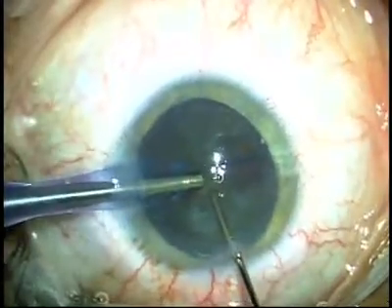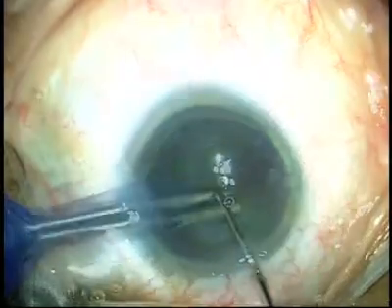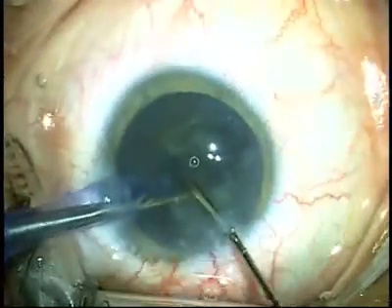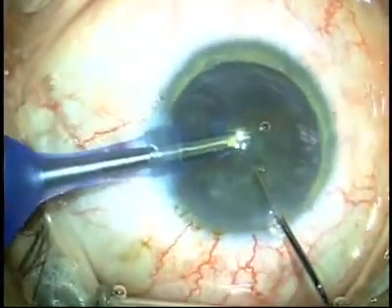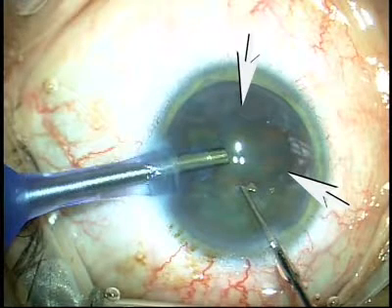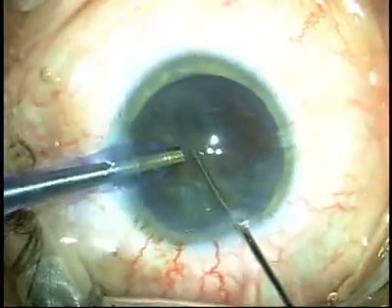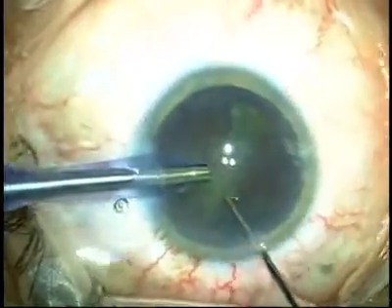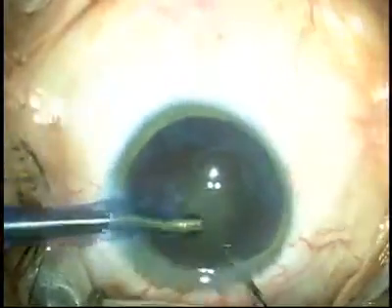Deep coring of the nucleus is done here along with cracking. Once this is done, the pieces are brought up into the anterior chamber very carefully, and you can see a very nice bounce in the area illustrated by these arrows. This indicates that the Helon 5 is being rapidly evacuated from the chamber. The second bounce is seen with the second piece, and essentially all the Helon 5 is now out of the chamber.